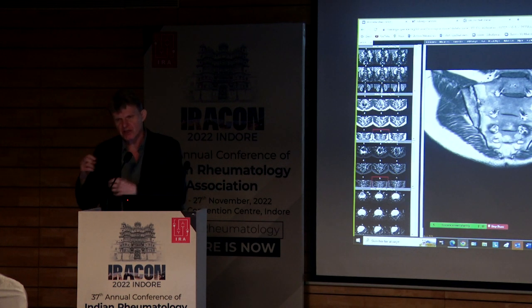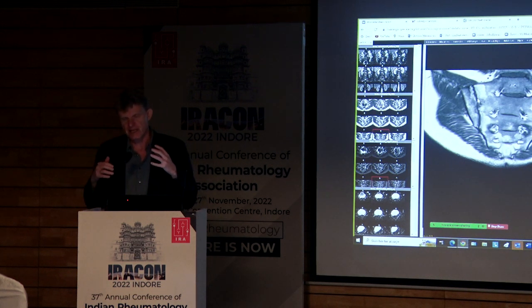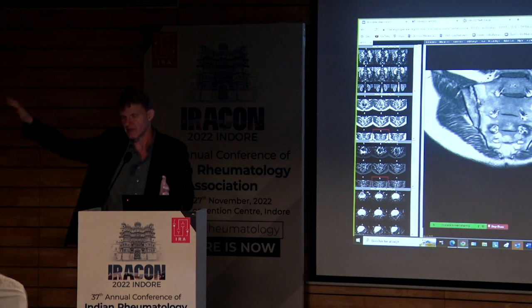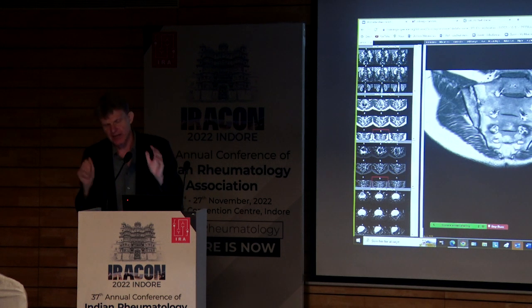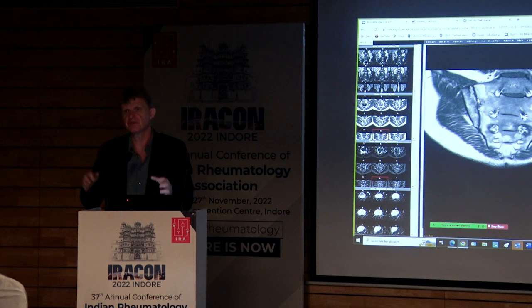But if the patient is not doing that well, and you're not really certain why, that's why I would do the MRI. If there is a lot of inflammation left in that MRI after half a year of treatment with some anti-TNF, or whatever amount of months, 4 months, 6 months, then you can say, well, this drug doesn't work. It doesn't decrease my inflammation. It doesn't take it away. We must try something else.